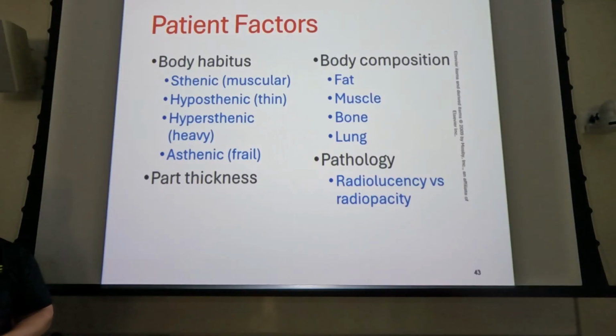Okay, so the things that used to affect our contrast and our density on our image really don't so much anymore. You can affect those things, and primarily how you affect those things is really, really screwing up your technique. What you might get is, if you undercollimate and you have a lot of direct exposure to the image receptor, your machine can't really figure out what you're doing, then you get an error in the reconstruction of your contrast.